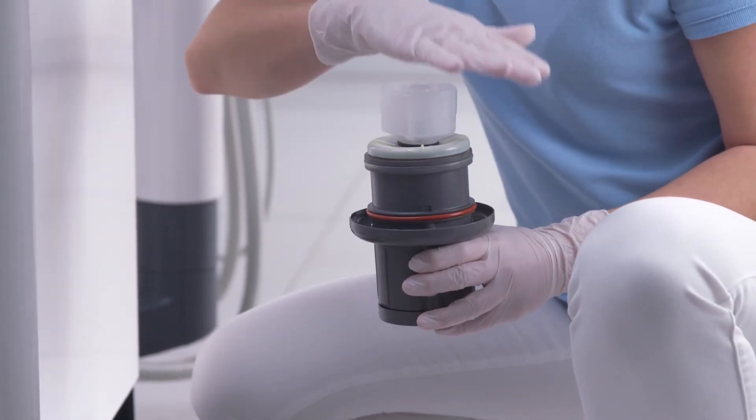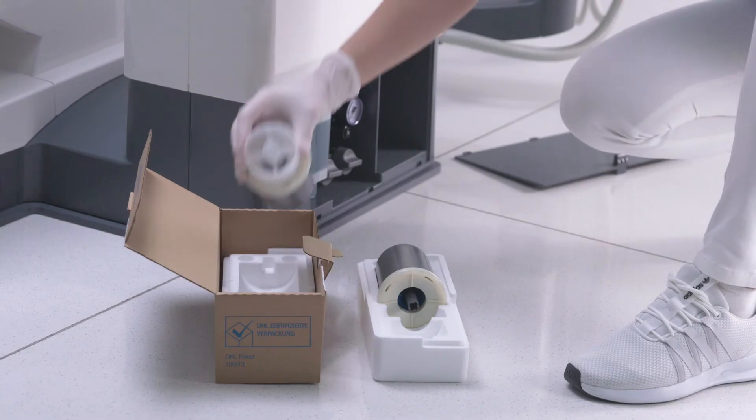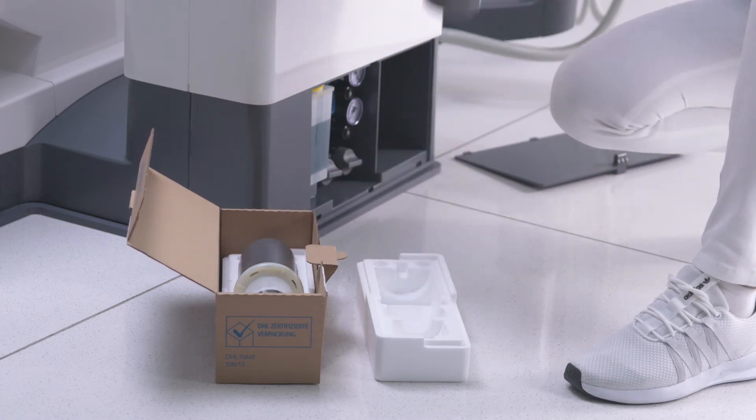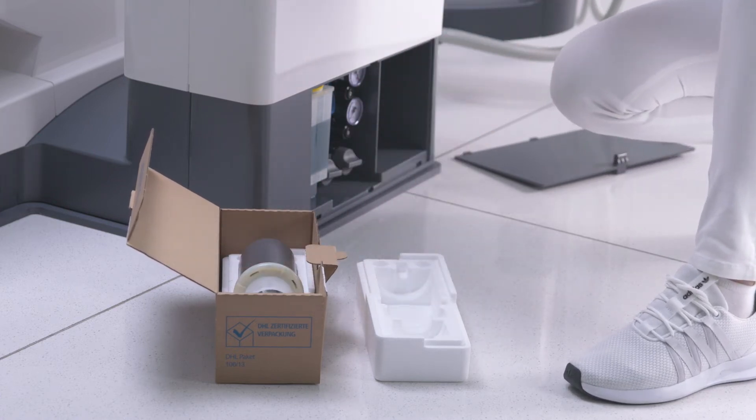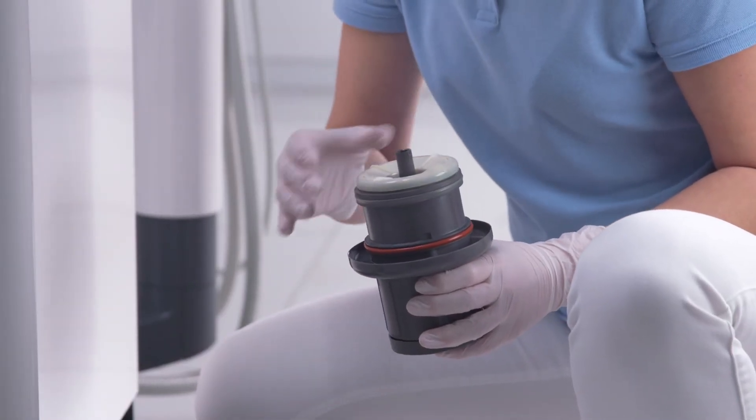Attach the transport cap to the amalgam rotor. Remove the amalgam rotor with the transport cap from the lower part of the amalgam separator. Place the container in the special packaging. Insert the new amalgam rotor in the lower part of the amalgam separator.